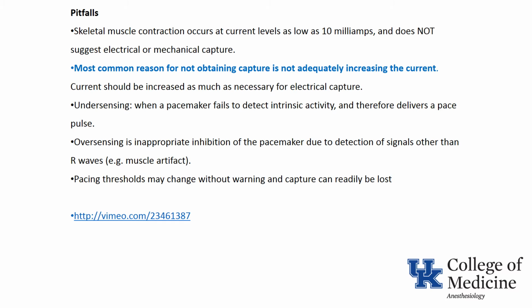There are pitfalls with transcutaneous pacing, and as it says on the slide, skeletal muscle contraction can occur at low amperages, low currents, and it does not necessarily mean that there has been electrical or mechanical capture. Current should be increased as much as necessary for electrical capture.